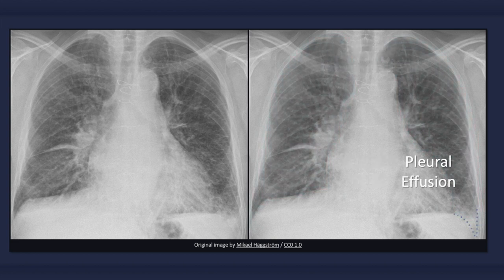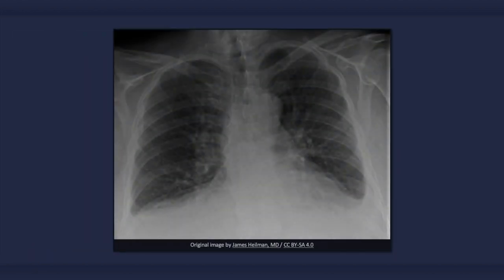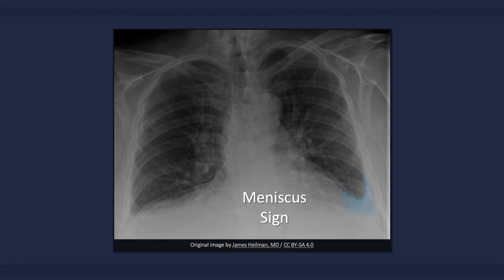Now let's turn attention to the bottom right corner of the radiograph. There is a decrease in definition of the left costophrenic angle, consistent with a pleural effusion. In another x-ray of congestive heart failure, bilateral pleural effusions can be identified by the loss of costophrenic angles and obscured hemidiaphragms. Below the left lung we see the meniscus sign, in which the opacity has a concave upper border and is higher laterally than medially.